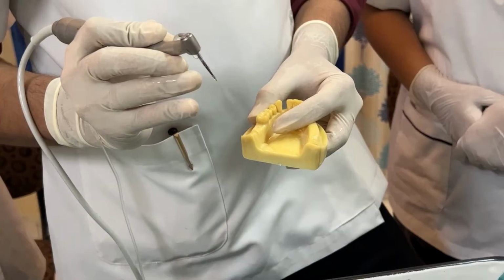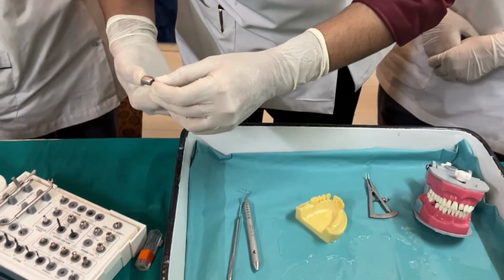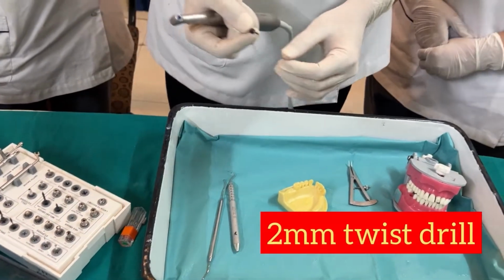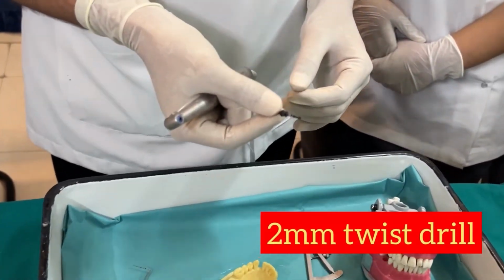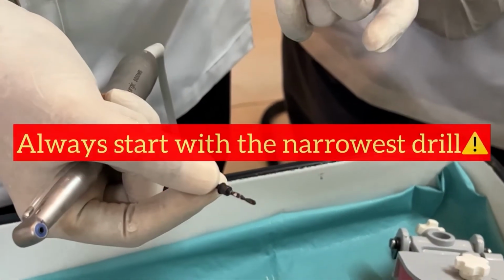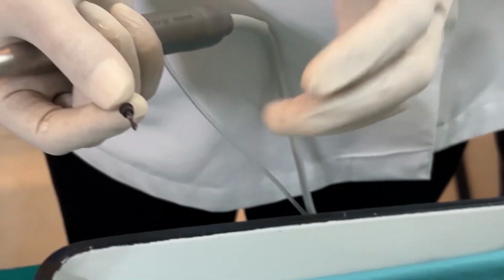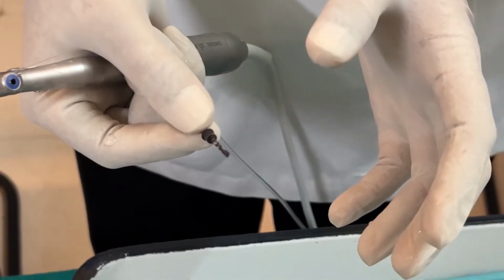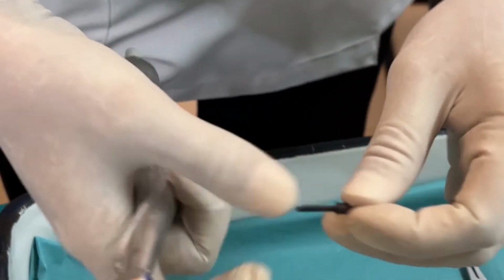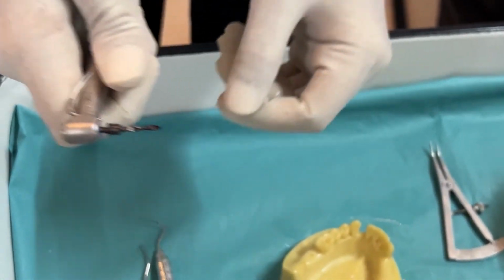Okay. So now once this is done, we move on to the next drill. The next drill is what? It is the 2 millimeter twist drill, the first drill that we have to start. Always and always we have to start with the narrowest drill, and then move on to the last drill, which should be roughly 0.5 millimeter or slightly lesser than the diameter of the implant to be placed. So now this 2 millimeter twist drill I am placing.